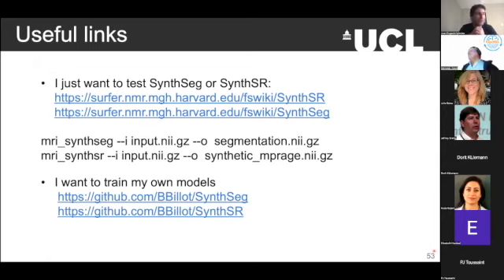Yeah. I try to be political in my presentations because I'm in the FreeSurfer lab, right? And if I'm going to quote Doug Greve, it's like, no, the important thing is to get it right. It doesn't matter how long it takes. That is true, but at the same time, oh man, FreeSurfer can be slow, right? These networks, it depends if you run on the CPU or on the GPU. If you have a GPU, processing a volume is approximately 2 seconds.